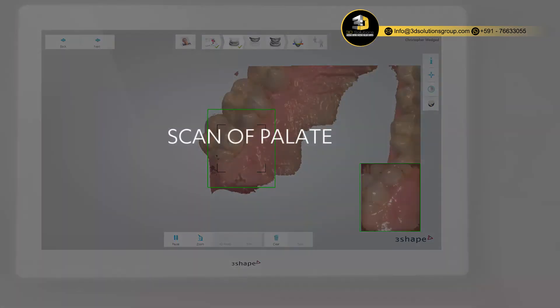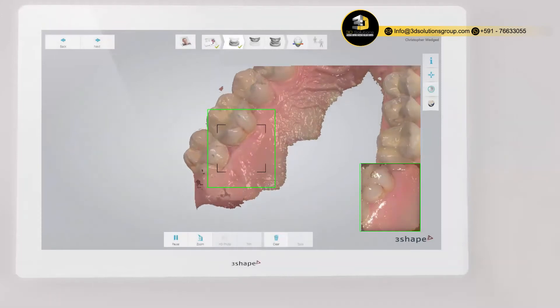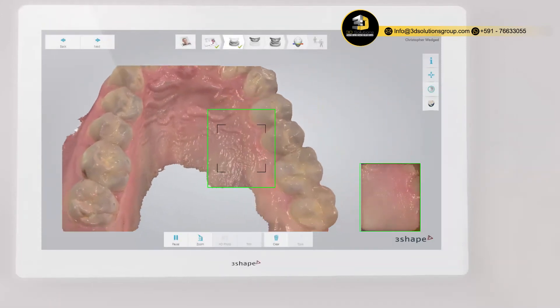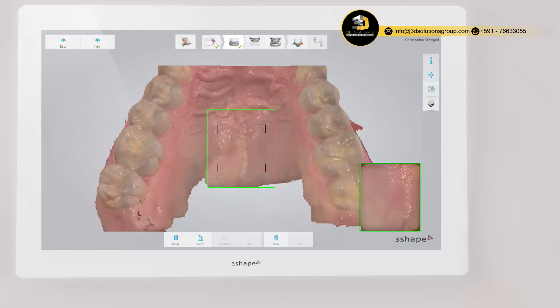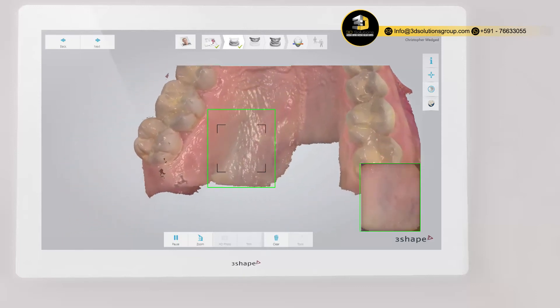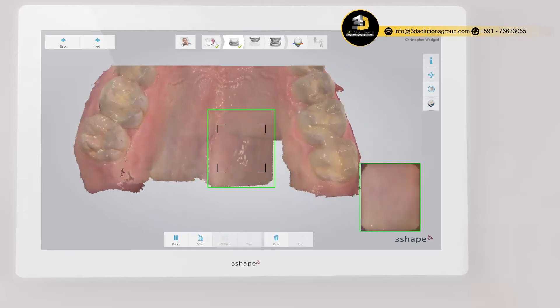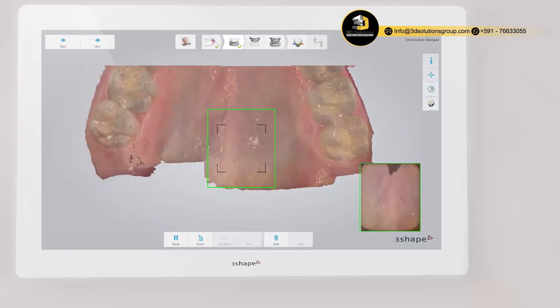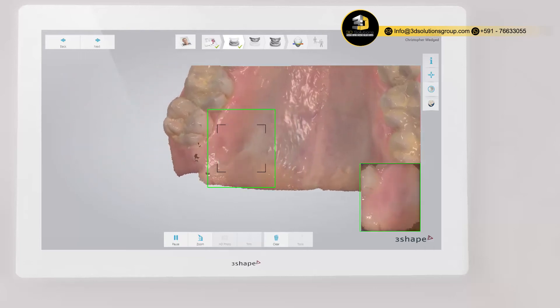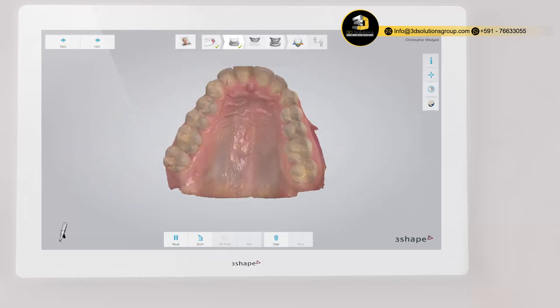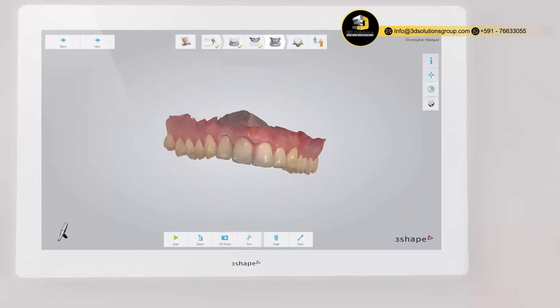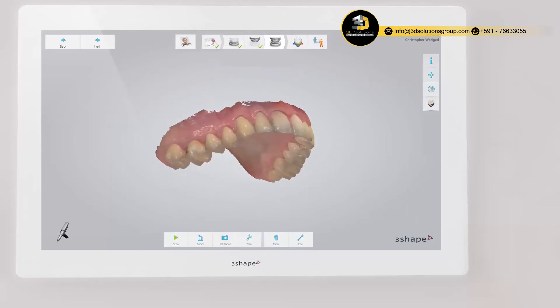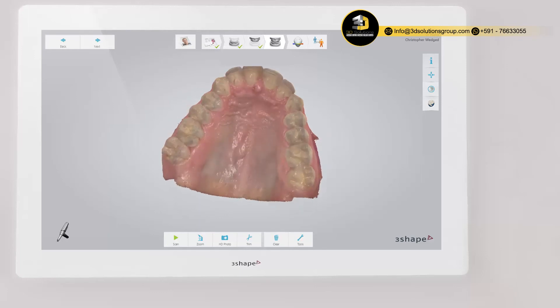If you wish to include the palate into the scan, swipe back to position the scanner behind the incisors and then slowly go from side to side across the palate in the distal direction. When scanning is complete, inspect the result and prepare the scan by trimming unnecessary parts. If an important area is missing, simply start scanning the area.